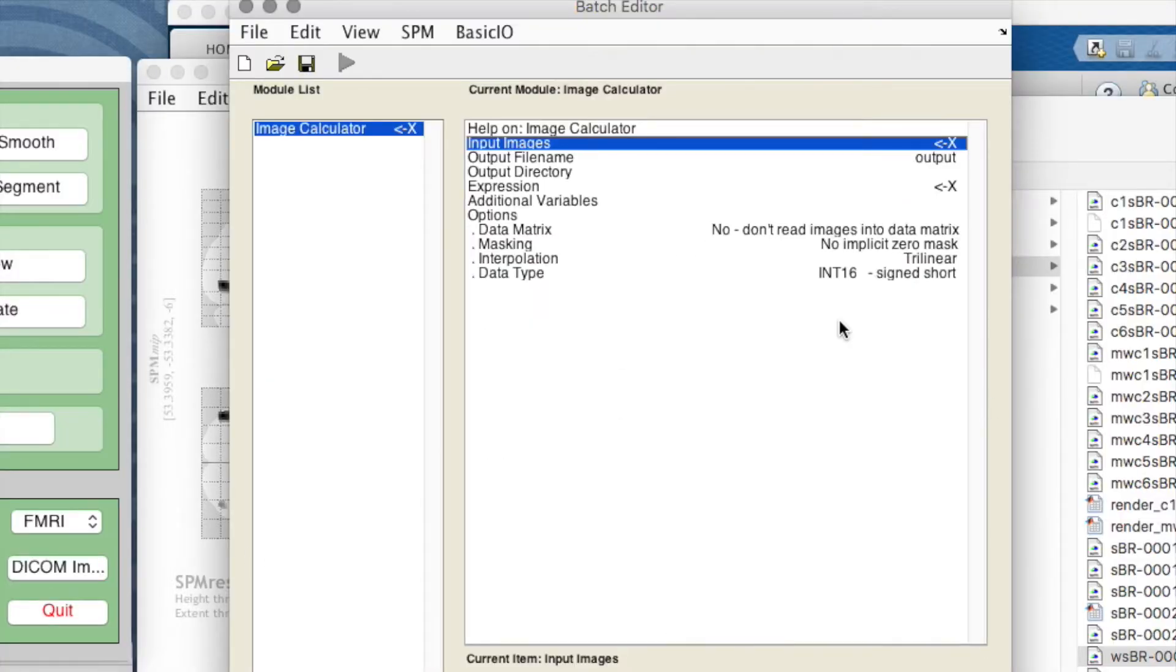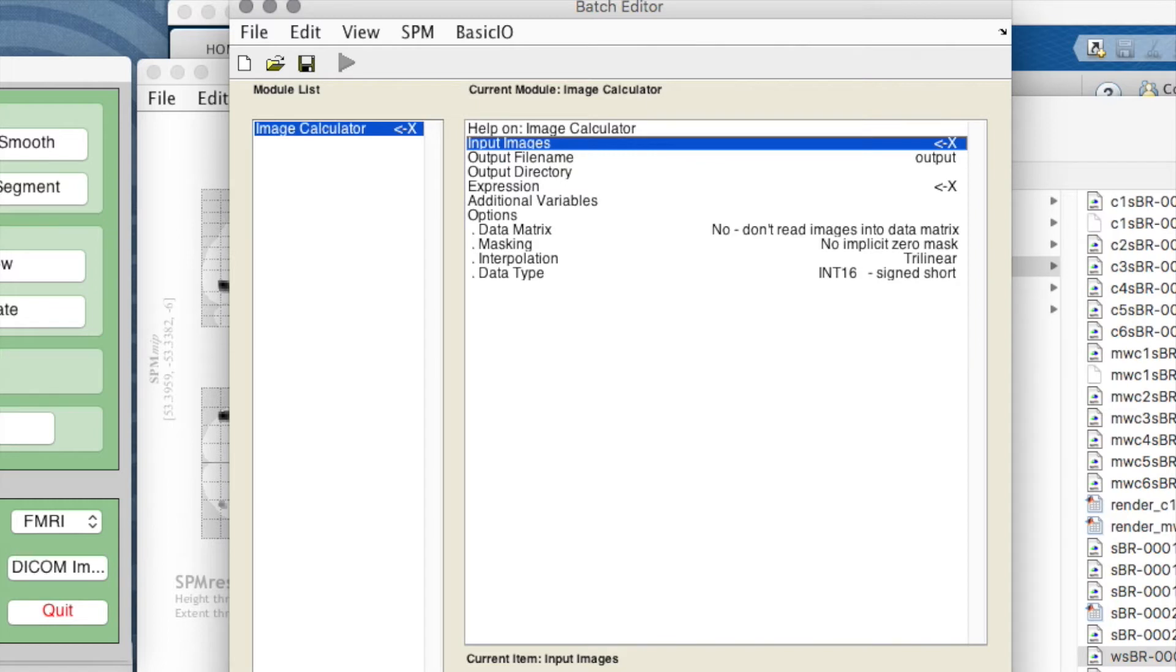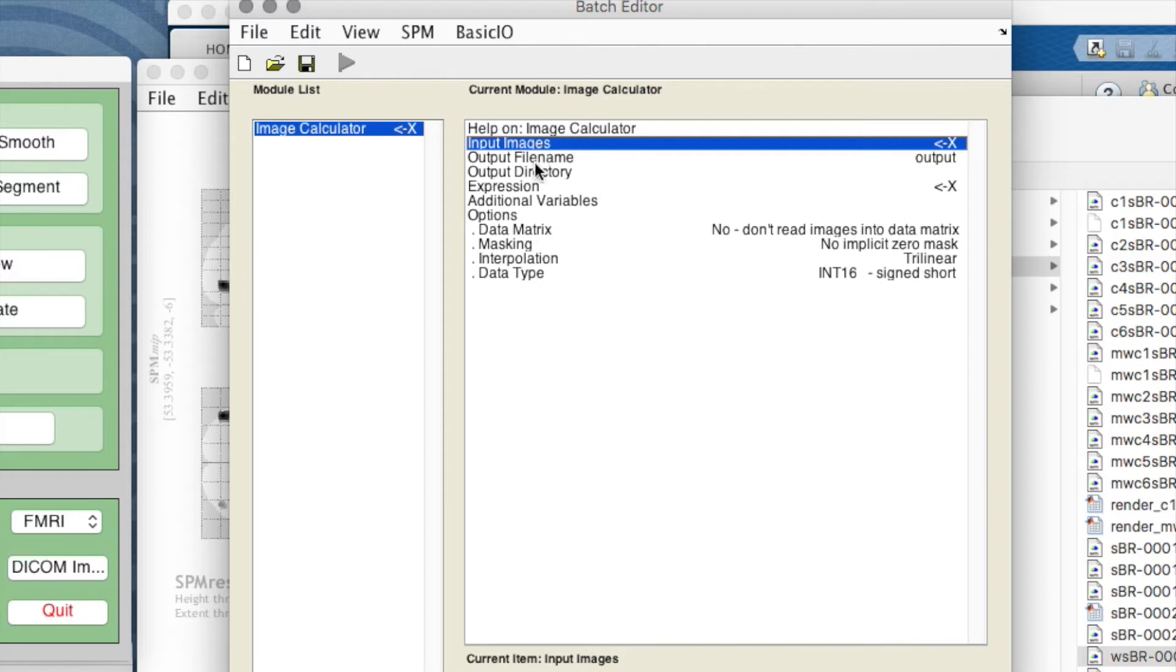What I want to do is calculate the average of our participants' structural images. This is the image calculator - ImCalc comes up in the batch editor and it wants to know what images do you want to perform calculations on, what you want to do with that, and what is the calculation you want to do.